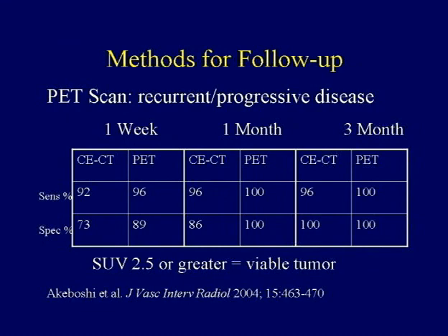The hope here actually is that PET will guide the placement of the needle. What we're hoping to do on the combined PET-CT scanners is identify where the hot focus is, just burn that focus in the bigger lesions, and so limit the procedure time. But one of the things we've been trying to look at is the uptake. Here is a case that we took on. Again, a fairly central lesion, but thought to be distant away from vital structures for us.